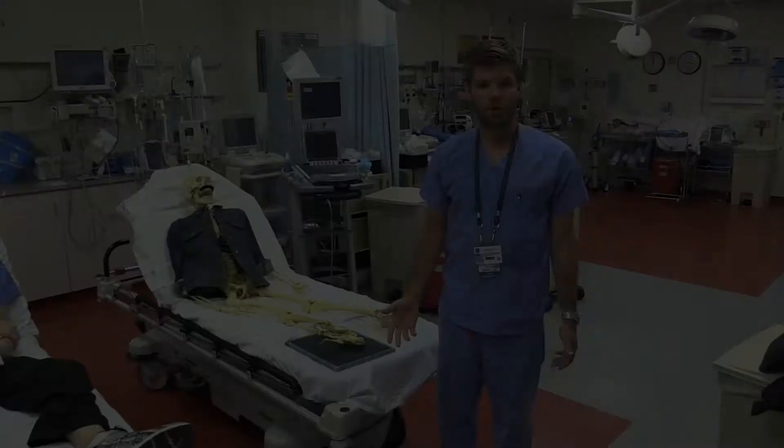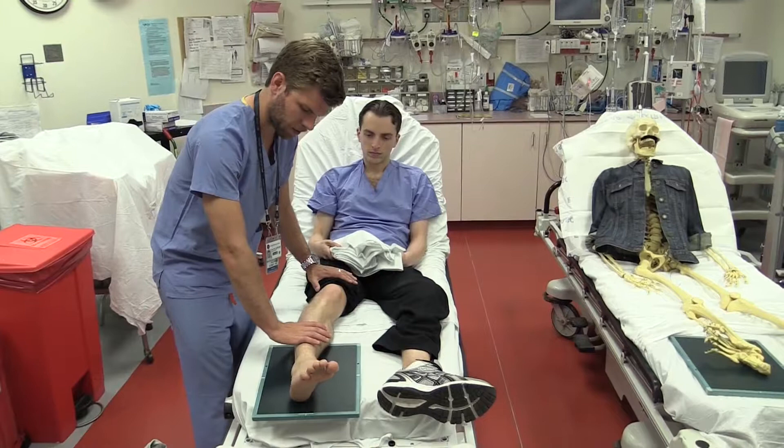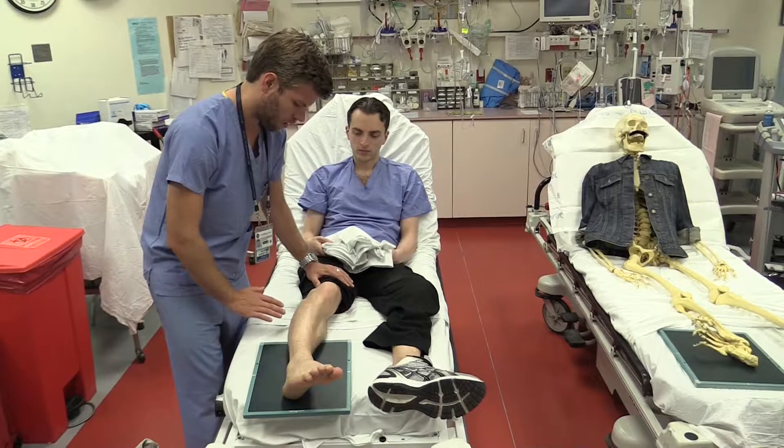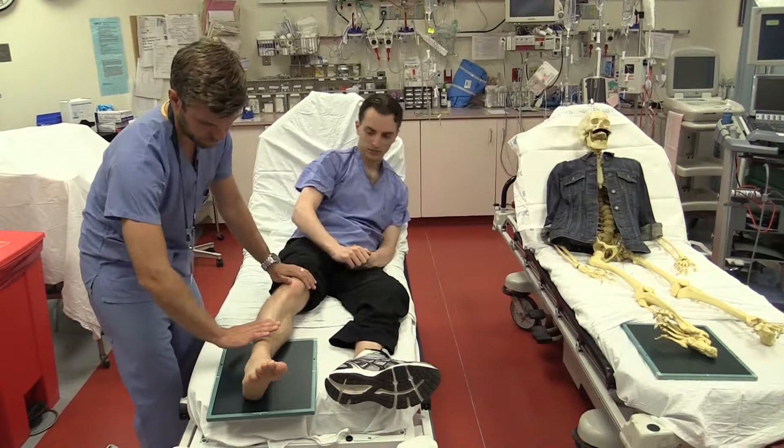Let's try it again with a real patient. First, locate your lateral and medial malleoli and, using internal rotation of the leg, bring them into the same plane as your x-ray plate. If your patient is in pain, they may move their leg, and I find it helpful to put a towel or other support underneath the buttock on the entrance side. So again, internal rotation.